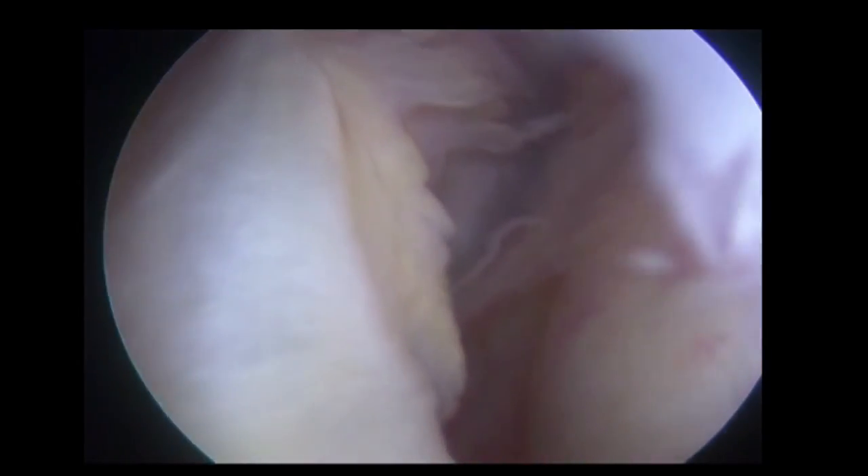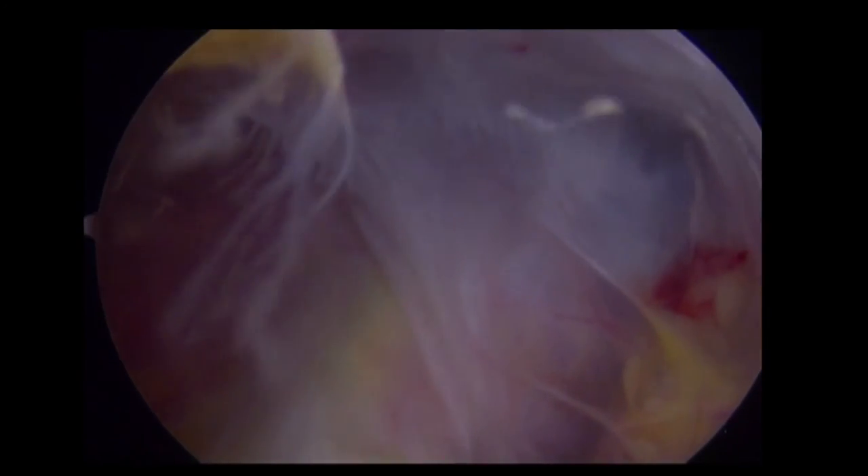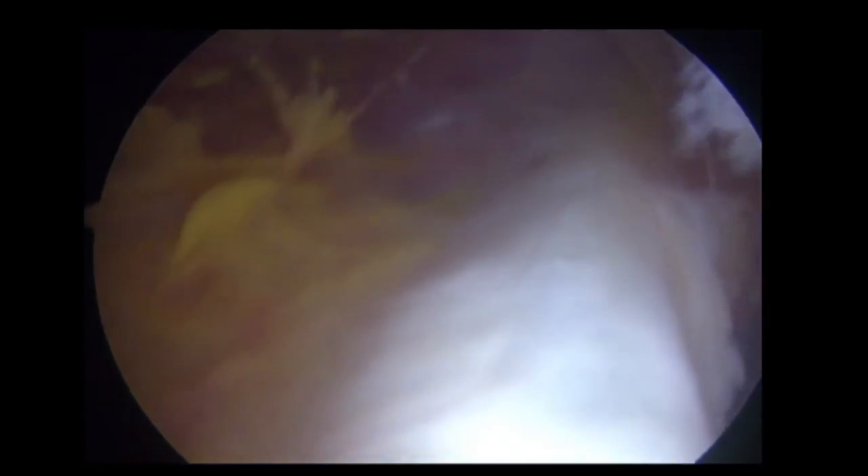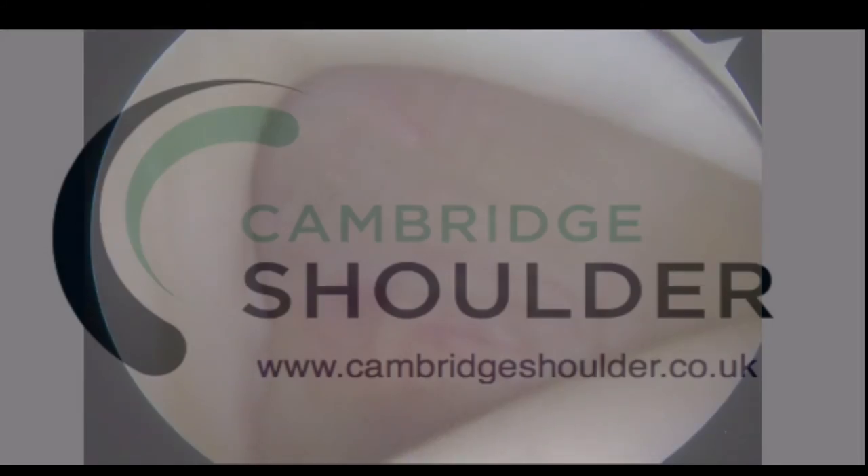The scope is now brought more anteriorly to get a view of the anterior labrum and capsule. As we internally rotate the shoulder we get a better view over the top of the subscapularis, and we can see the anterior part of the normal labrum and capsule, and the insertion of the capsule where HAGL lesions occur. Looking more medially we can follow the subscapularis. This is the arch of the coracoid, and in the distance will be the brachial plexus and various vessels. We now follow the subscapularis out more laterally and as we bring the scope back superiorly we are back at the long-headed biceps where we started.